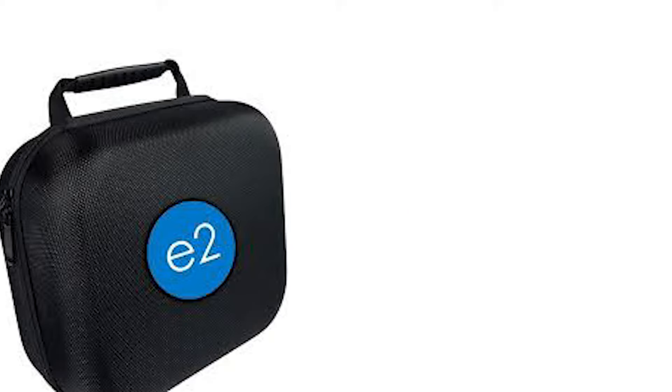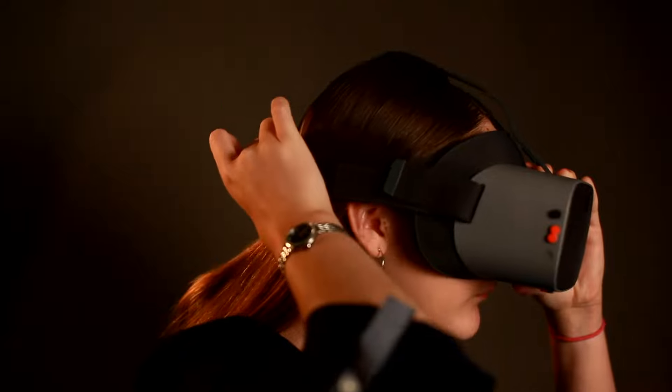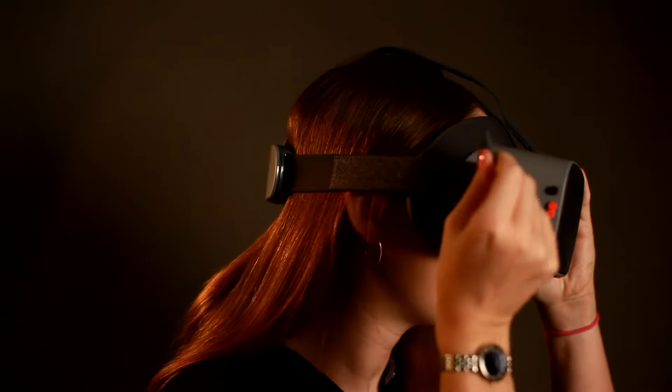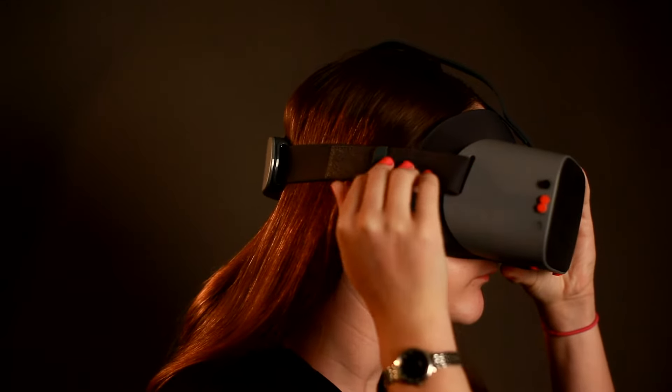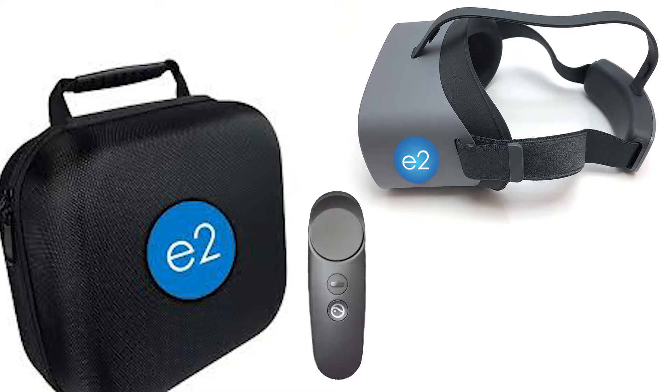Let's go over what's in the box. First you'll see the NewEyes E2 VR headset. You'll notice on the side of the glasses are the straps that adjust to fit your head by simply pulling them away from the velcro and then reattaching them to fit snug against your head. You'll also notice a little bag in the box that holds the wireless remote or wand, a USB cord for charging, and a USB wall charger.